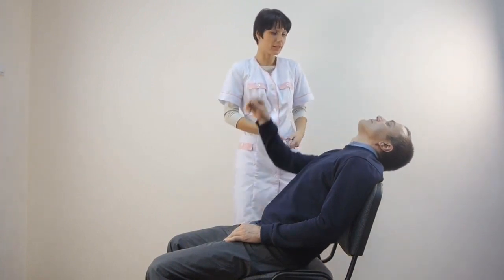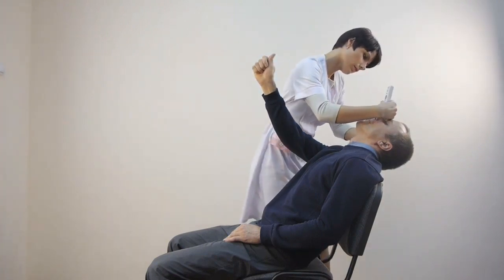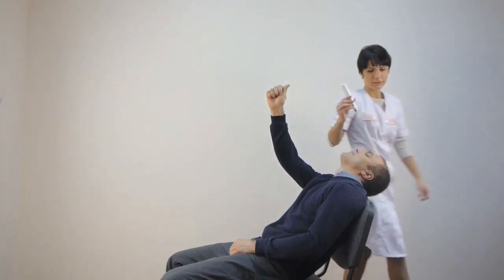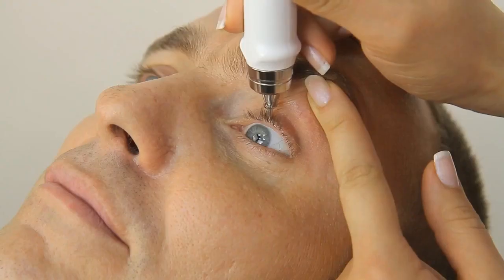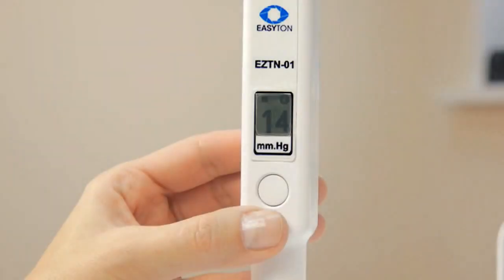While mastering the skill of stable tonometer usage, you need to select patients who have no history of ophthalmology pathologies, preferably young. You can self-check the results of your IOP measurements using Goldman's or Mukhlakov's tonometer. In case of significant discrepancies in the results, identify your mistakes as specified in the operating manual and adjust the measuring process accordingly. Follow these recommendations, gain the necessary skills, and become a confident user of the tonometer.